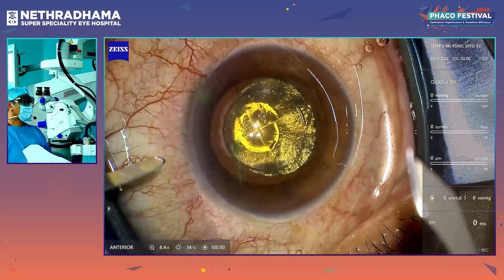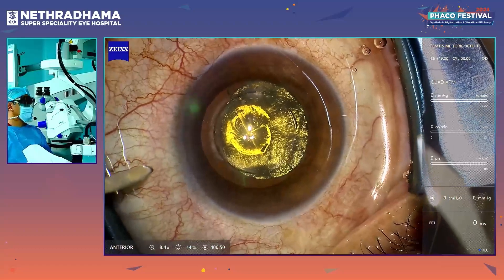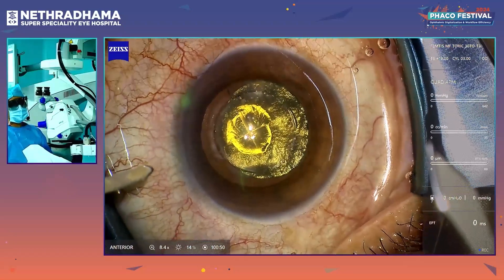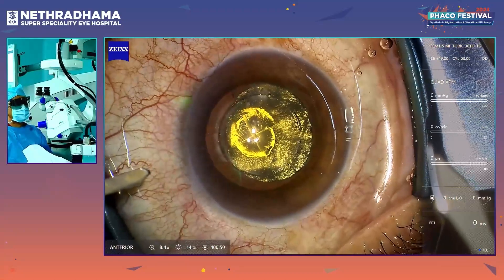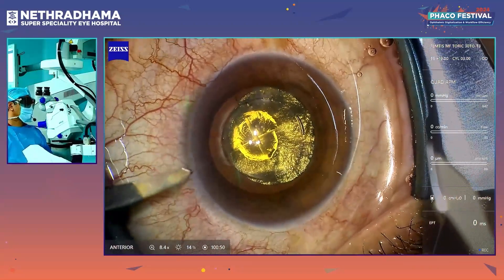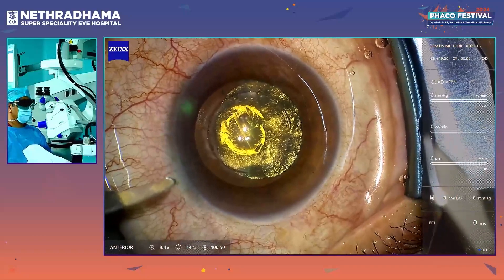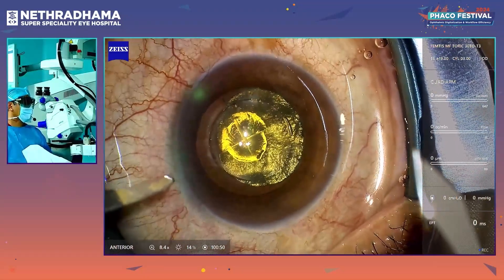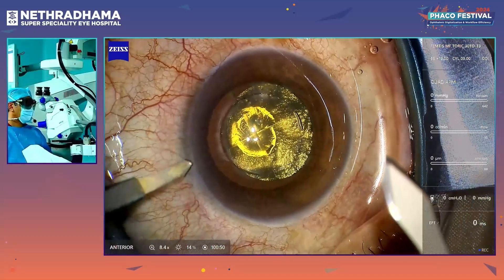In this patient I am going to implant the FEMTIS MF lens, which is the super premium lens. It is a trifocal, but it is not a diffractive trifocal — it is a segmental zonal trifocal, which gives good distance, intermediate, and near vision. However, it can be used only with femto cataract. You need a 4.8 mm exact capsulotomy for this, and so we have made a 4.8 mm capsulorhexis.